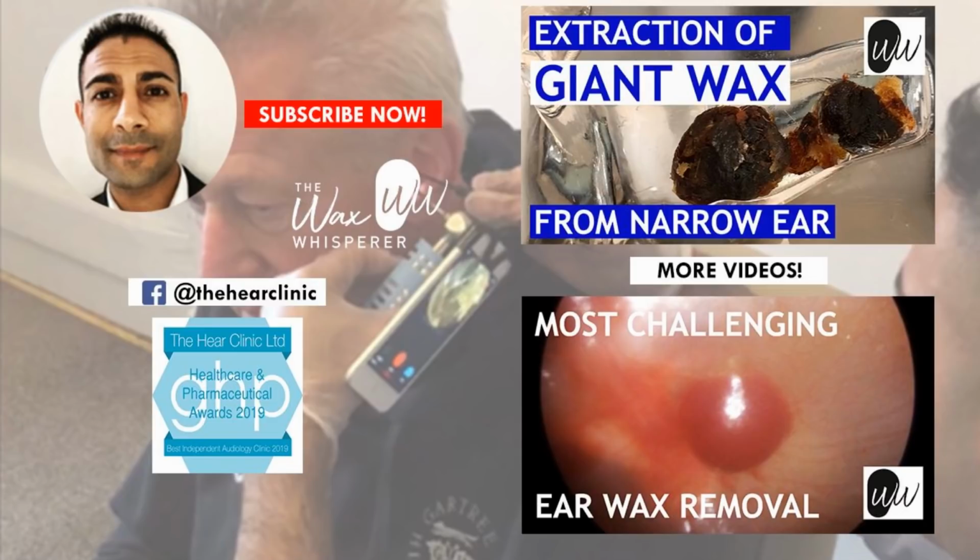So we thought, let's just leave the procedure there. The patient can hear, they're fine. That wax will now naturally migrate out of the eardrum. Advise them not to use a cotton bud to poke in the ear, because they're only forcing it further in.